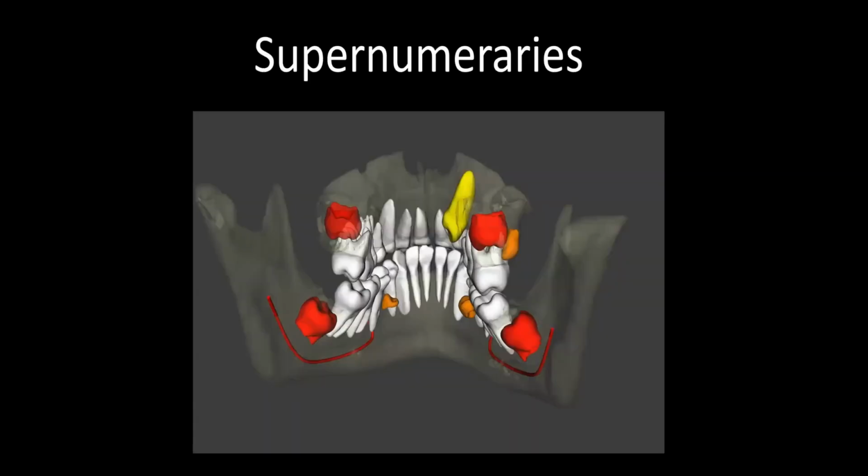We talked about the great value of segmentation for patients that have ectopic teeth or supernumerary teeth, right? So really what it comes down to is on these cases, would you rather know, or would you rather guess?